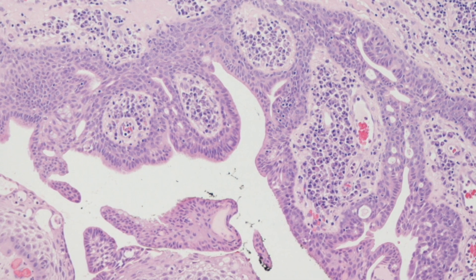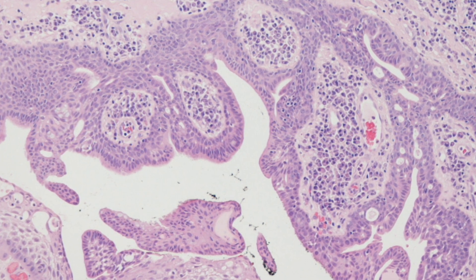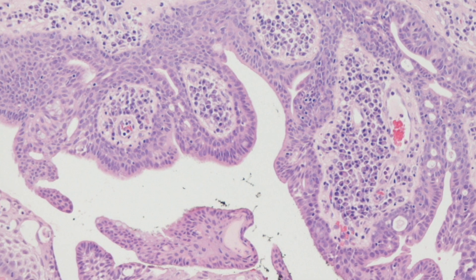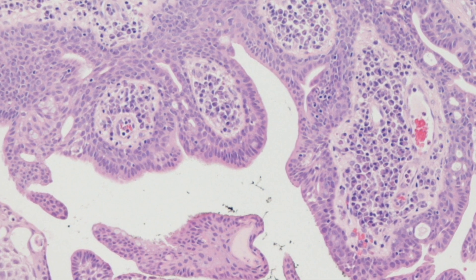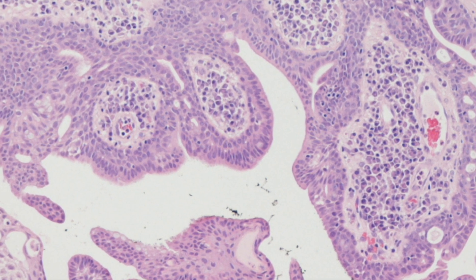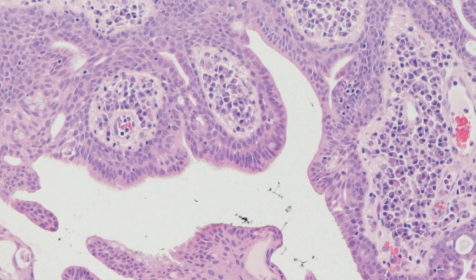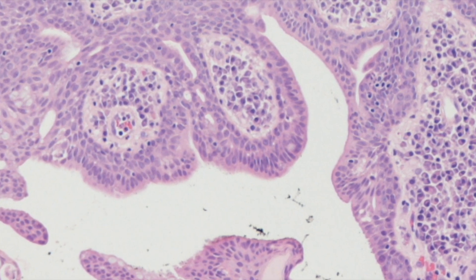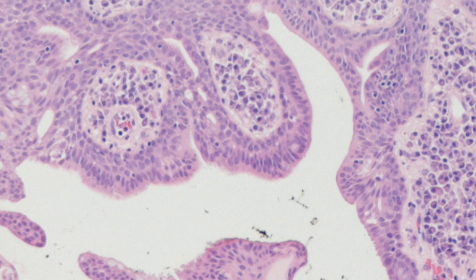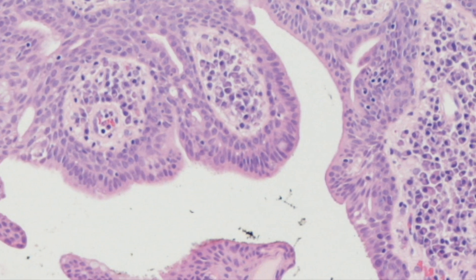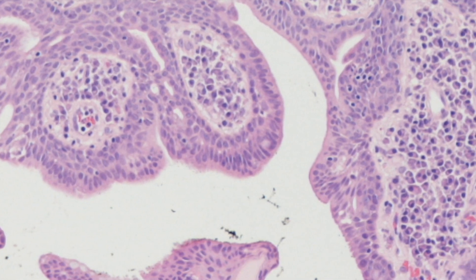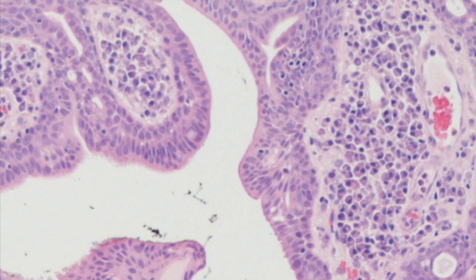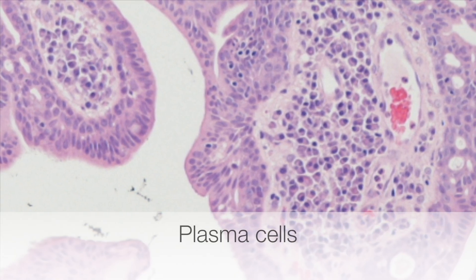Here you can see the double cell layer with an outer layer of columnar epithelial cells and an inner layer of basal cells. In the stroma there is a dense infiltrate of plasma cells.